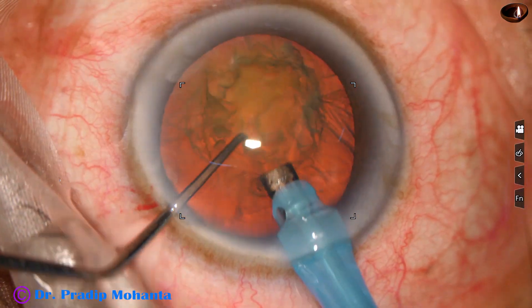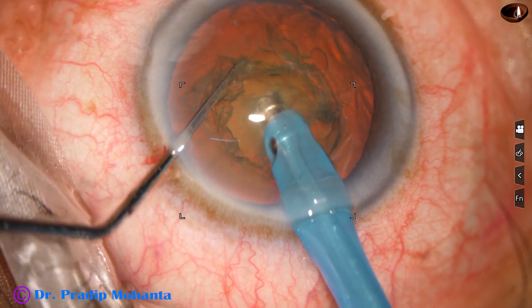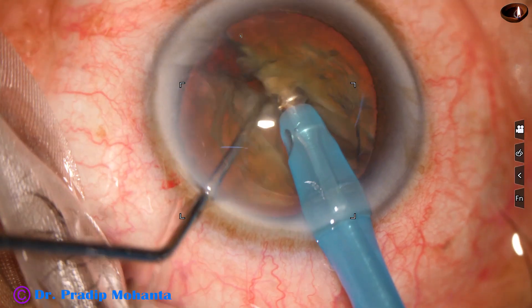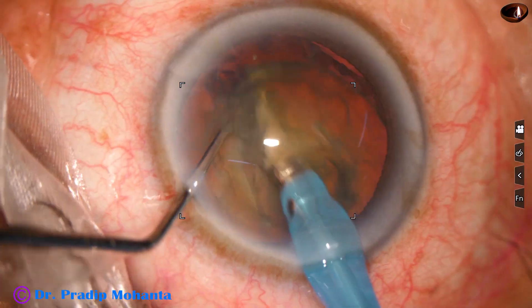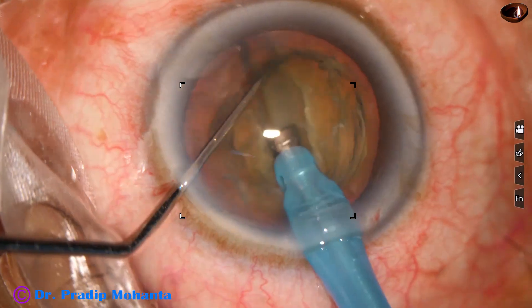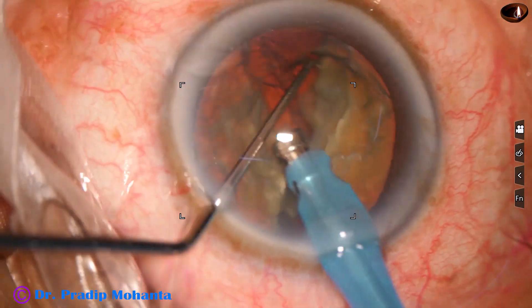The tip is buried just in front of the main incision into the substance of the nucleus and goes towards the opposite equator. Then the chopper is used to get a nice crack. Now the nucleus mass is rotated 180 degrees. Coming to the other side of the crack, the nuclear mass is separated into two heminuclei.